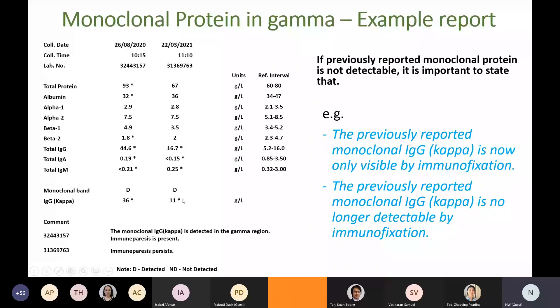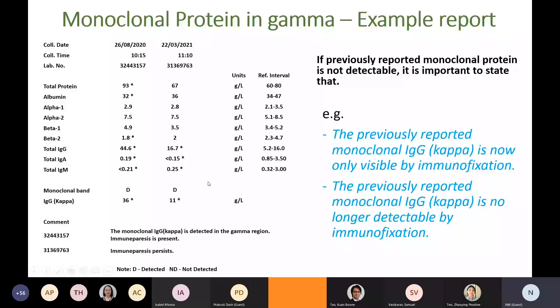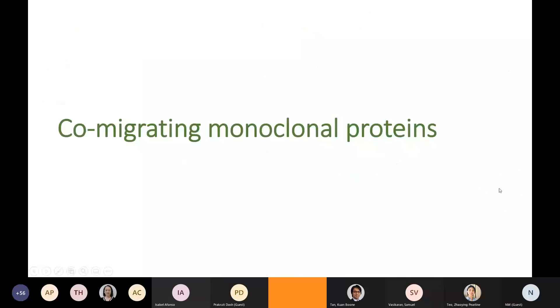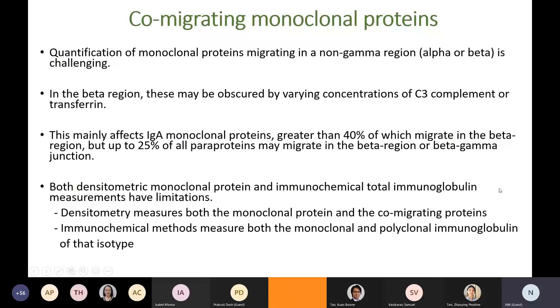Even if you don't use cumulative reporting, it is essential to check previous electrophoresis records. Otherwise you won't be able to determine whether this is the same monoclonal protein or not. If the previously reported monoclonal protein is not detectable, you must mention that in the comment. Quantification of monoclonal proteins migrating in the alpha or beta region is challenging and is one of the areas with significant variation between labs. In the beta region, monoclonal proteins may be obscured by varying concentrations of complement C3 or transferrin, mainly affecting IgA monoclonal proteins.